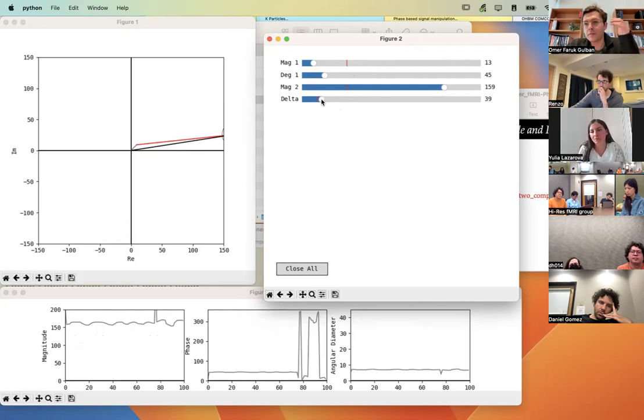This is also why Ravi Menon says that you can detect phase changes in macro vessels, like macroscopic veins, mostly very reliably because they are mostly made of blood, right? So any phase changes there, like becoming more oxygenated or less oxygenated, have a very direct and large effect on the measured phase.